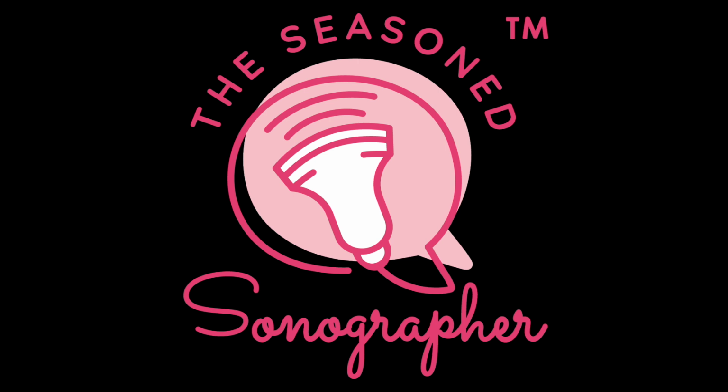A lot of times from their reproductive endocrinologist, the providers will want a follow-up scan in our office or at the hospital, again, to confirm that viability after they've been released. Evaluate the maternal pelvic anatomy for any fibroids, ovarian cysts, or any congenital anomalies. Maybe there's a bicornuate uterus or a heart-shaped uterus or septate uterus.